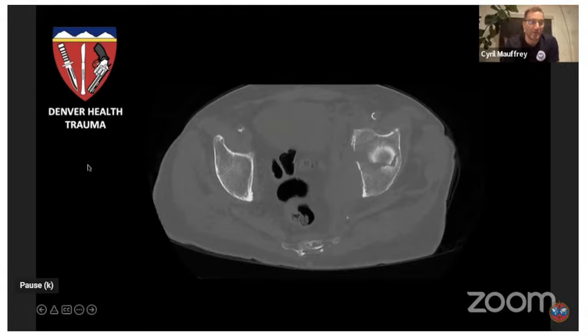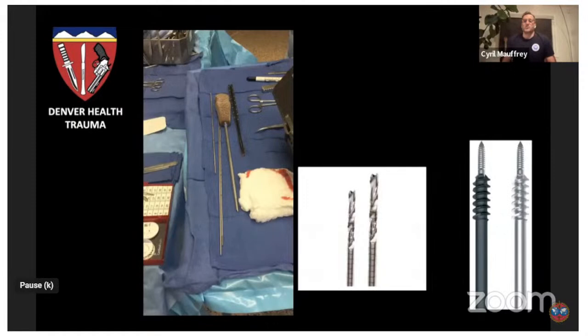These are the tools that I use for any pelvis fractures, but specifically for percutaneous fixation. I use what's called a pig sticker, which is a broken cannulated screwdriver that is beveled real sharp. This is very useful for an antegrade anterior column fracture and an antegrade posterior column fracture where the angles of entry are very steep. And it's nice to have a sharp instrument that holds your wire through the soft tissues.